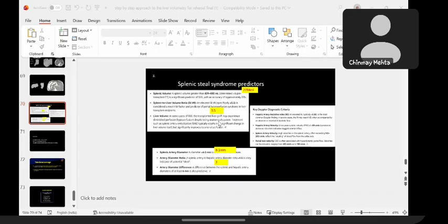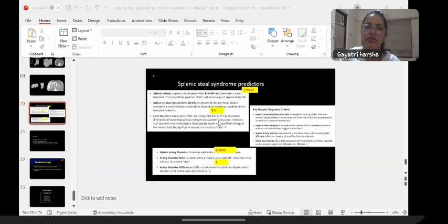The next question is, what is the cutoff diameter to call them dilated and when it is normal? And also, is there any cutoff for rejecting a donor? Okay, so based on diameters, we don't reject the donors. The anatomical position of the arteries, mainly the arteries, is more important.